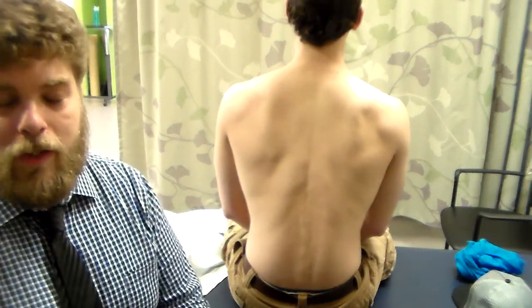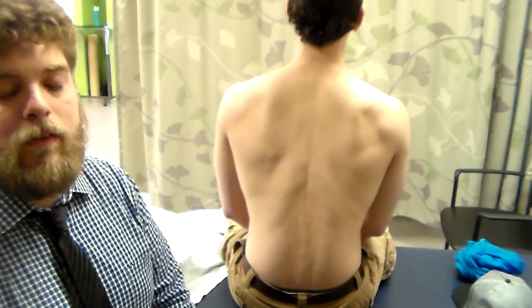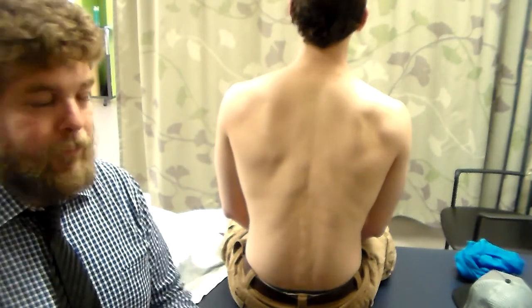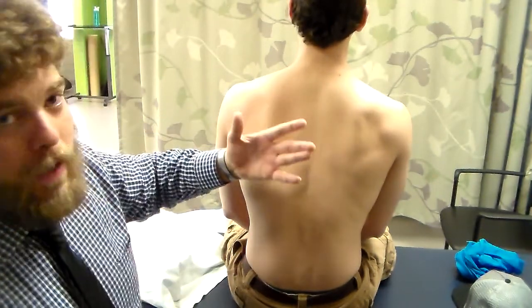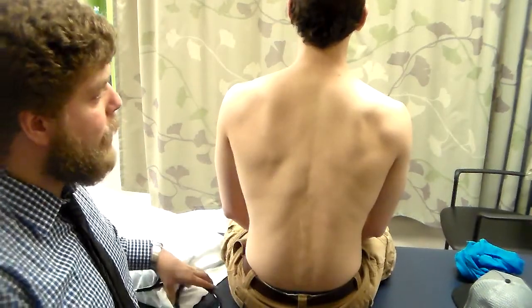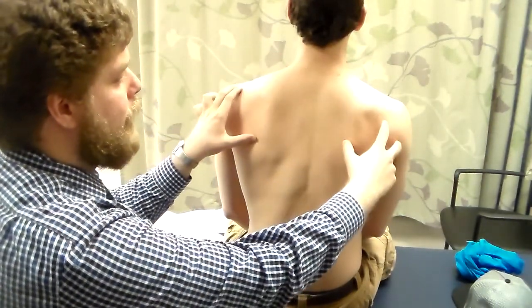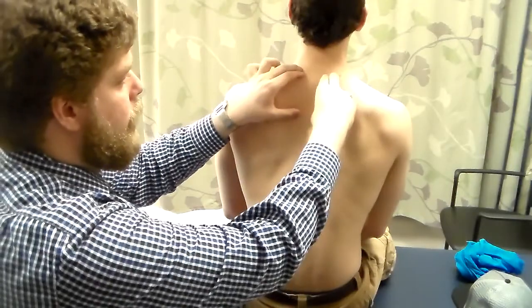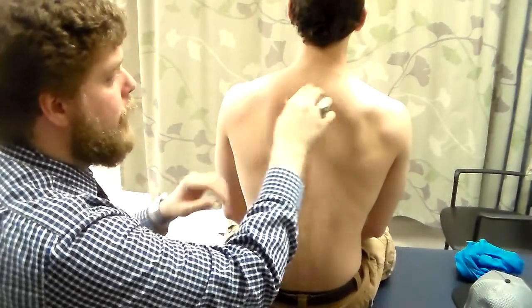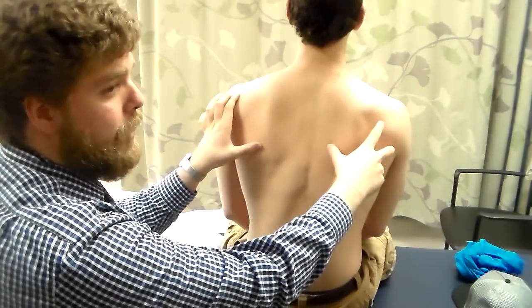The next segment we'll auscultate are the posterior segments of the upper lobes. Again, these are identical. The easiest way to think about this is remembering that these segments kind of form laterally, like this. They start very narrow around T2, T3, and then extend in this fashion here.